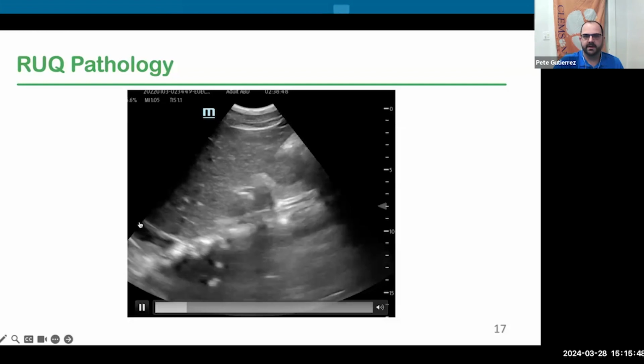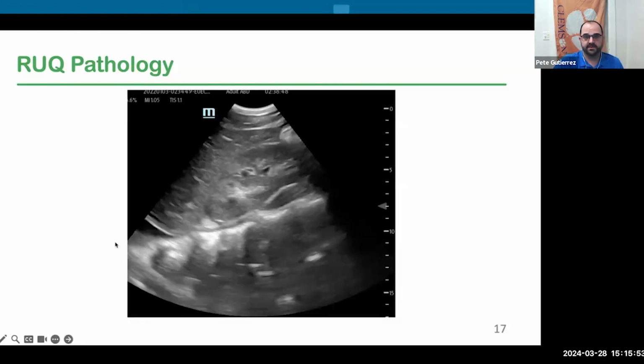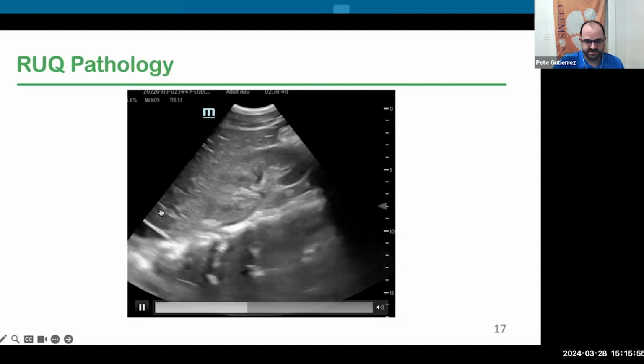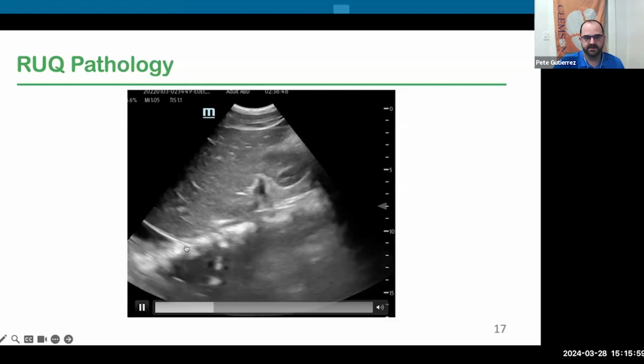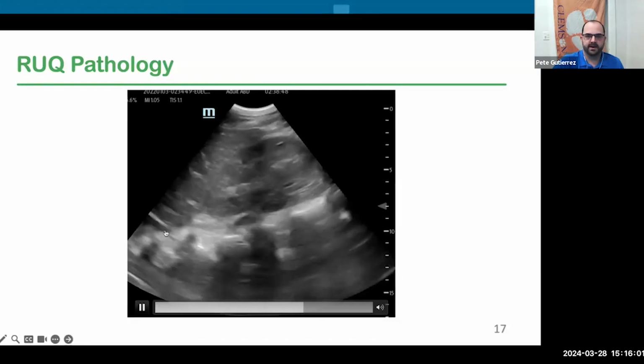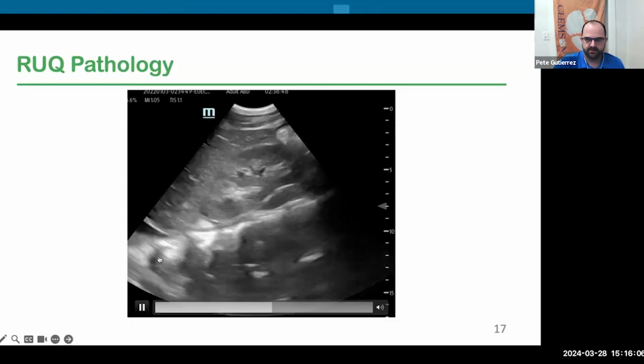But now imagine there's fluid in that thoracic space and it's taking that air-filled lung and pushing it out of the way. And now you're able to see through that area, and you can see the spine up above where the diaphragm is. So if you see spine up above the diaphragm, that's a positive spine sign. And if that area looks black, then it's fluid.